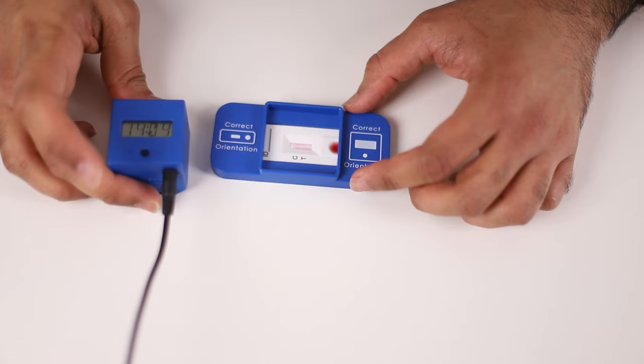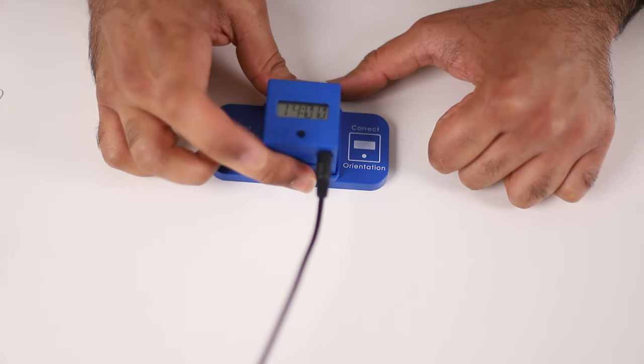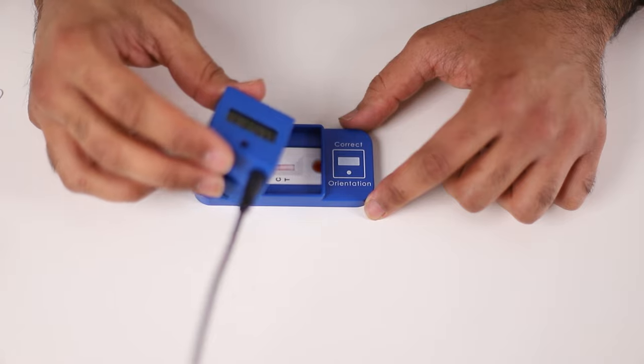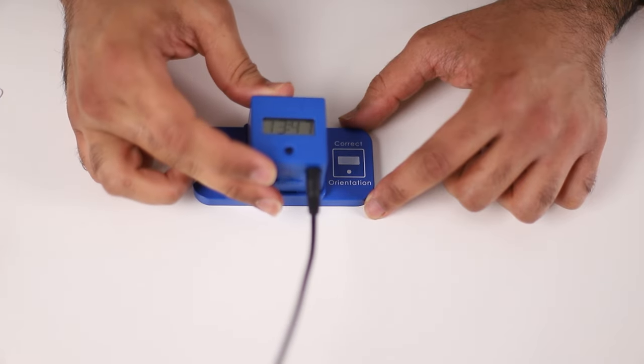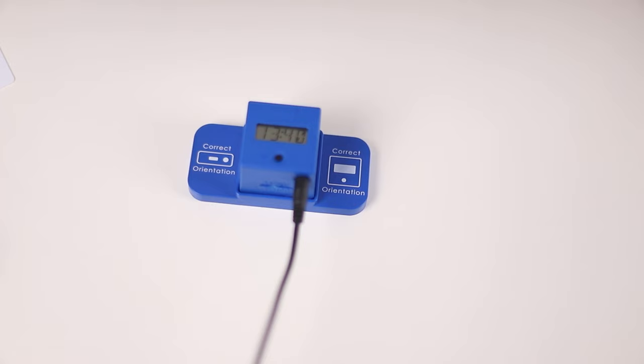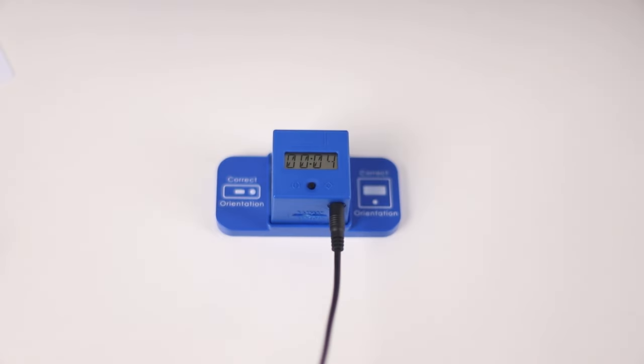Drawing your attention back to the test strip, you can see the blood is now being pulled through. Place the cassette on top of the vitamin D test strip and then take the reader and place it on top of the cassette. If you take the reader off you can see that the control and test line is still coming through. Once the reader is placed on top you can carry on with the rest of your day — there is no interference needed. The vitamin D test is now running and it will run by itself without any intervention necessary.